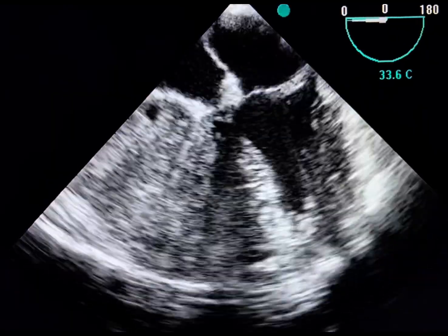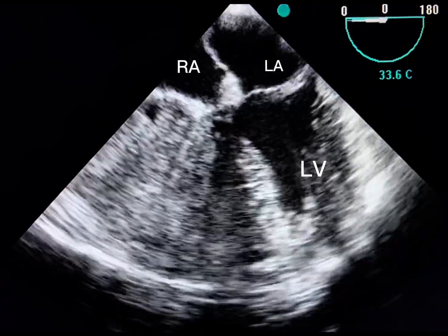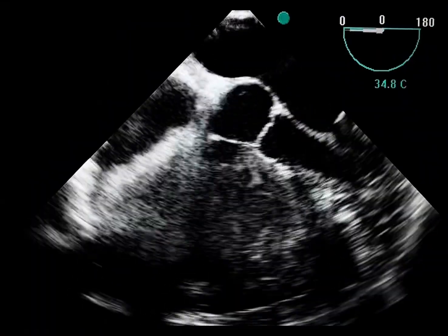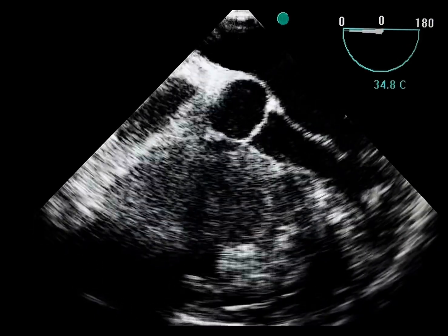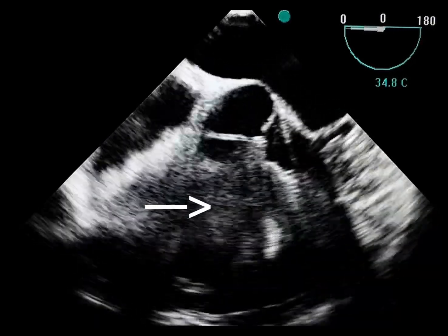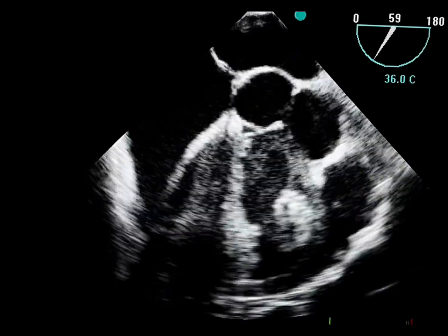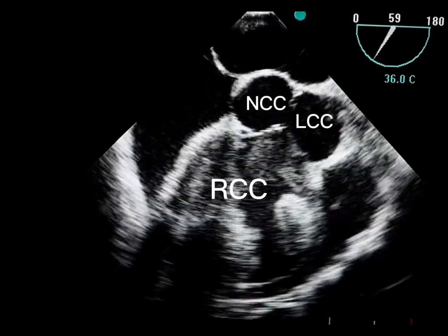Now let's explore the transesophageal echocardiographic views. In this view, we can see a large mass occupying most of the right ventricle, but it's actually a large cyst-like structure containing clots with swirling blood flow, originating from the right coronary cusp. Indeed, this is a large sinus of Valsalva aneurysm with a severe smoky pattern and multiple clots.